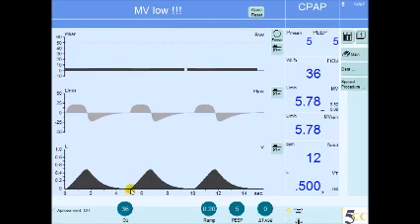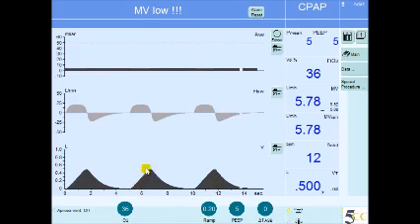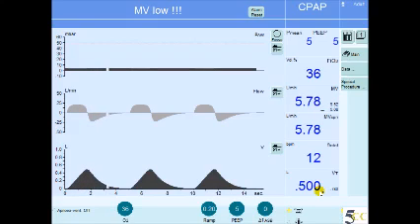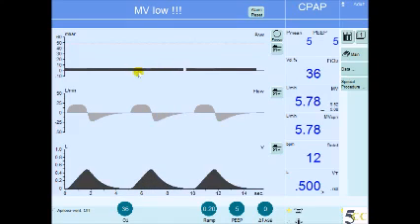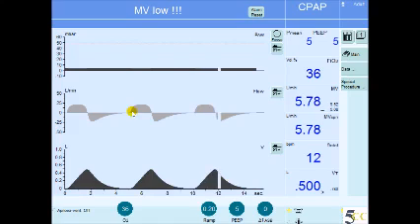As a result of the flow, the volume goes up from zero to the tidal volume, which is around 500 cc in this breath. The breath is initiated by the patient, terminated by the patient — it's negative pressure inspiration — and the flow is a sine wave. This is a spontaneous breath.